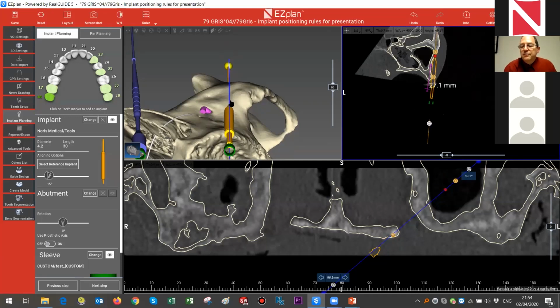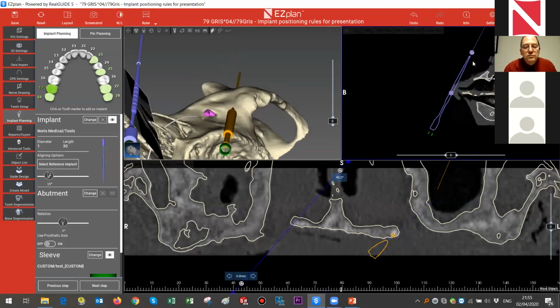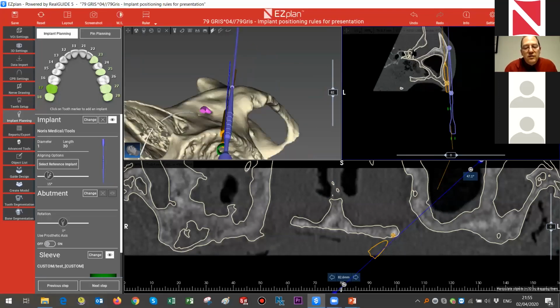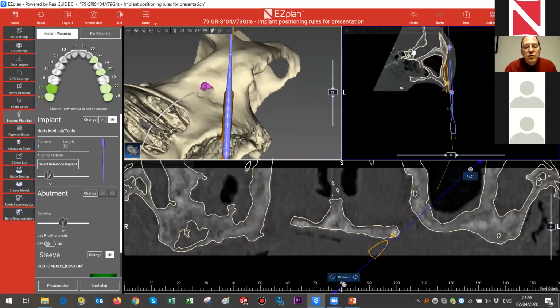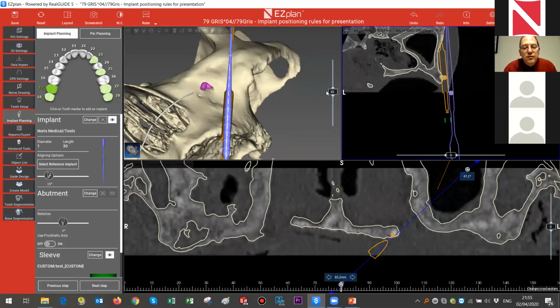That's where you are. Now you take the measuring tool, the depth probe from the kit. You put it on the bone from the same angle that we're looking at. You have to look that you're above. Basically, we want to put the tip on the position you want to measure. I put the tip on this position here, like that, maybe further in.